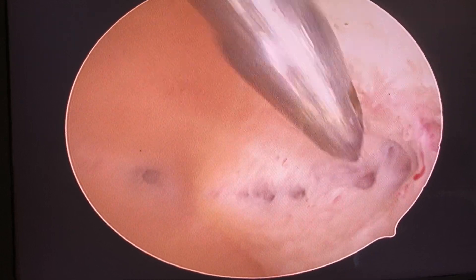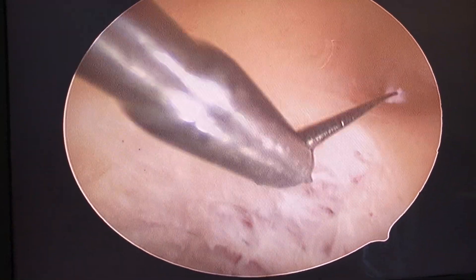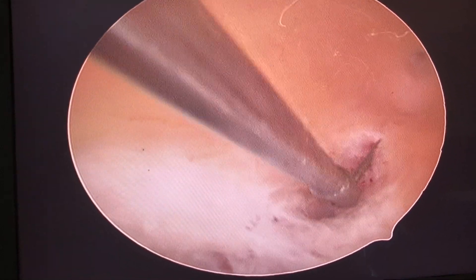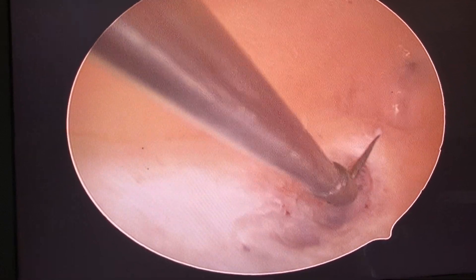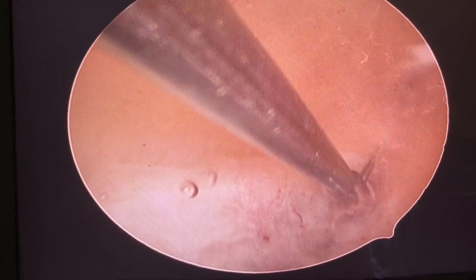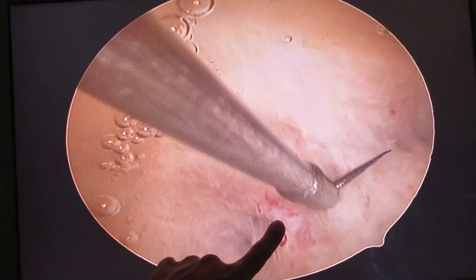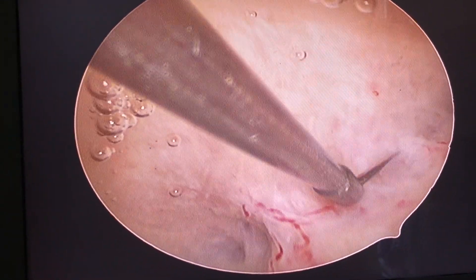Everybody in the operating room is looking with amazement. Should I go to the other side? This side is finished. This is how I've been at it, and then I finish the last part in the center. I will avoid it because of the fluid pressure.